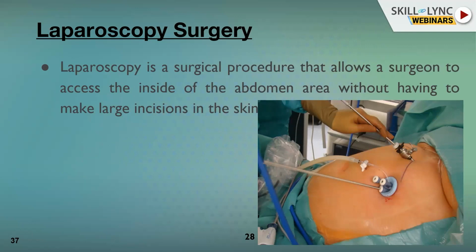for example, to do any surgeries, you need to have three holes: one for the working instrument, the other one for the light, and the other one to make gas. Okay, so you send gas in such a way that the abdominal cavity can be inflated, so that whatever working area can be seen properly.